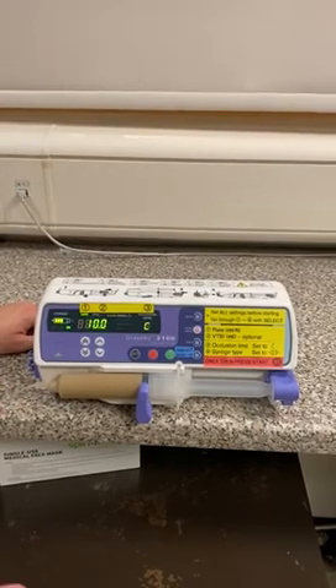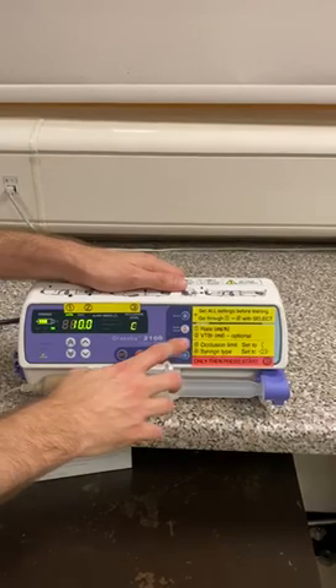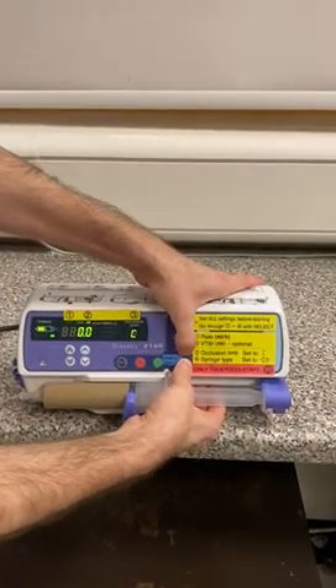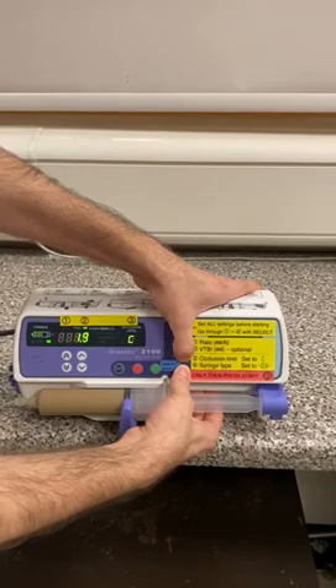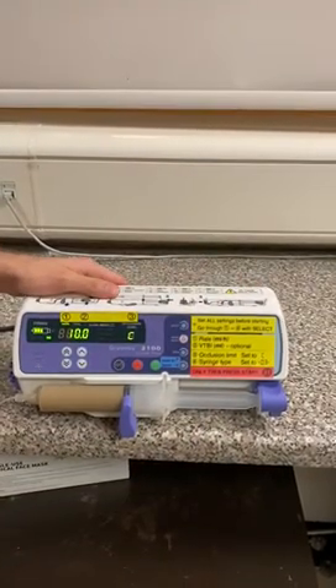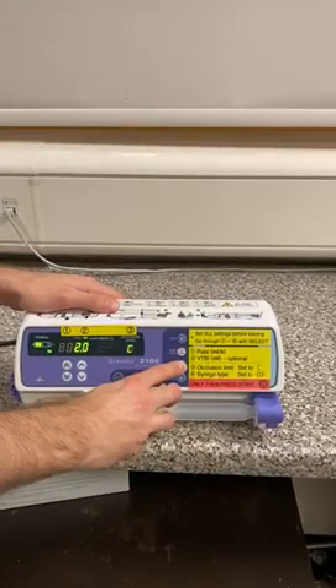If we want to give a bolus, it's really straightforward. We have a little sticker here that says 'hold to bolus,' referring to these two buttons. We're going to hold them down at the same time and watch the display count up. If I release it at 2 mil, we've given a 2 mil bolus. If I want to see how much I've given in total, all I need to do is hold the total button — and that shows 2 mil.